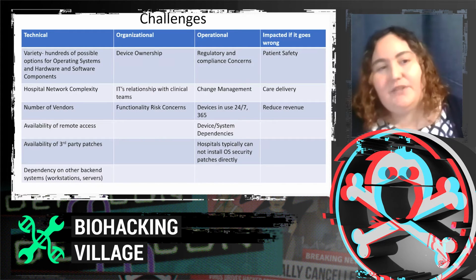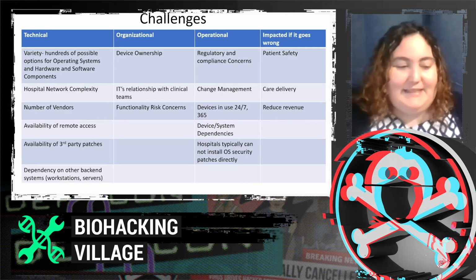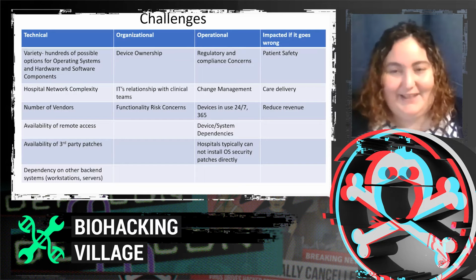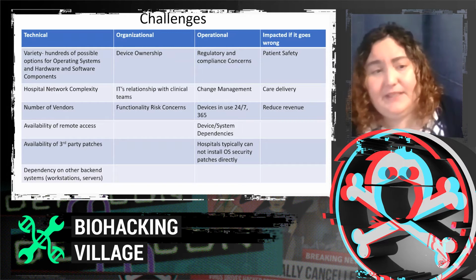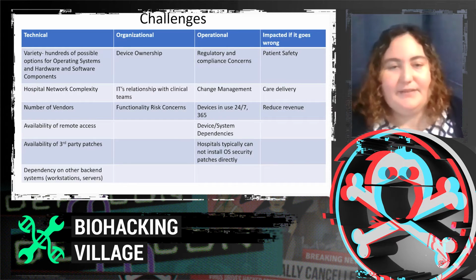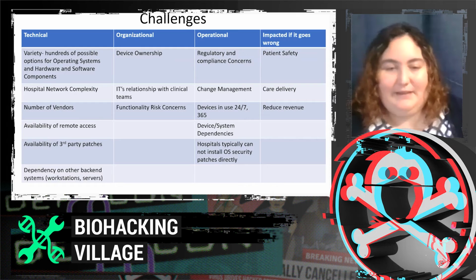There's organizational issues. So who does this device belong to? Does IT have a good relationship with the clinical team? I mean, in smaller places, the bioengineering guy and the IT guy and the IS guy are probably all the same person. But it depends on how that person deals with the clinical staff, and then what are the functionality risks. There's also regulatory and compliance concerns, what the change management process is. Devices are in use 24 hours a day, 7 days a week. Device systems, like I mentioned earlier, they have dependencies.